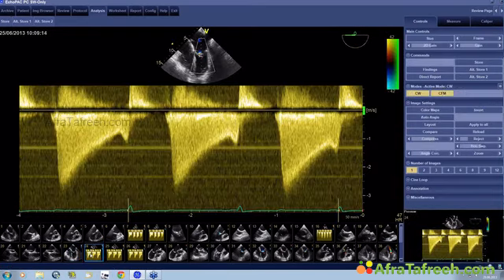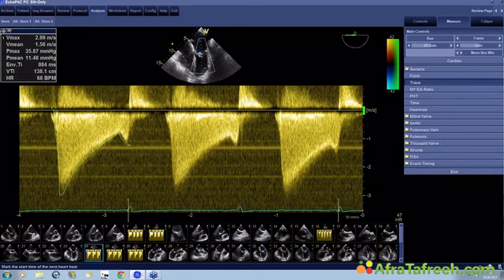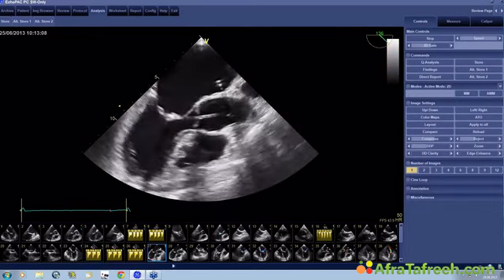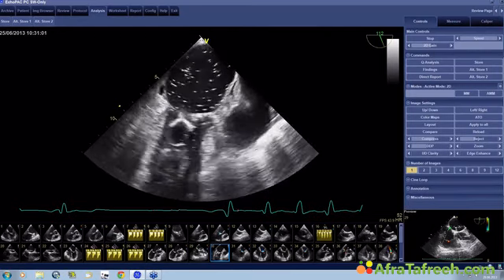We did another measurement of the gradients, which were, I would say, at least comparable to what we got from transthoracic echo. Don't forget that you have completely different hemodynamics if patients are under anesthesia. So it's not unusual to find lower gradients when you are in the OR or in the cath room. But still, the gradients are high enough to document severe mitral stenosis. Then we looked for the right spot to put the balloon through. And here is now the procedure itself.